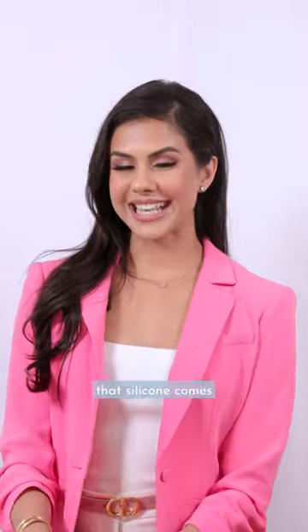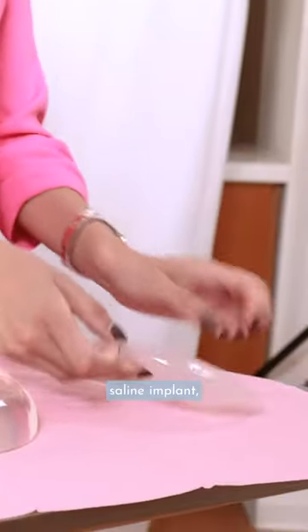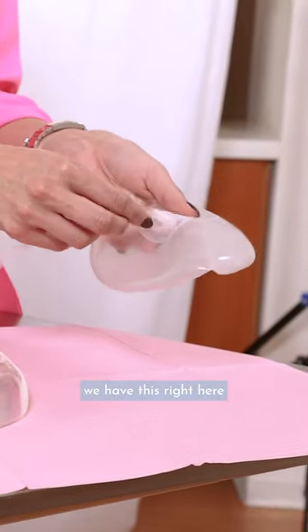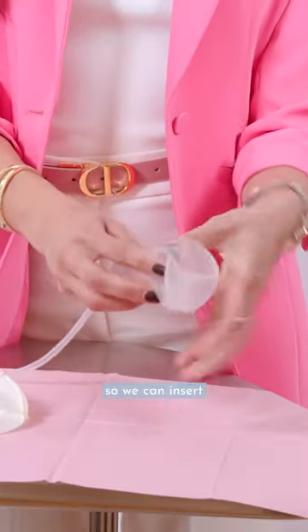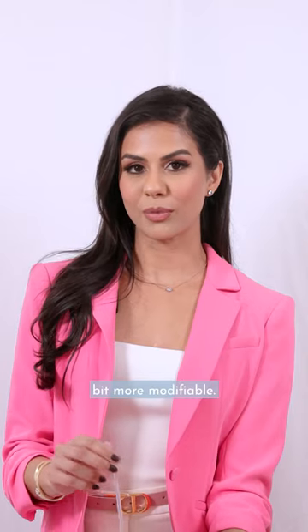The other thing is that silicone comes in preset sizes. However, in this saline implant, we have this valve right here, so we can insert the deflated implant and actually fill it up with saline — making it a little bit more modifiable.